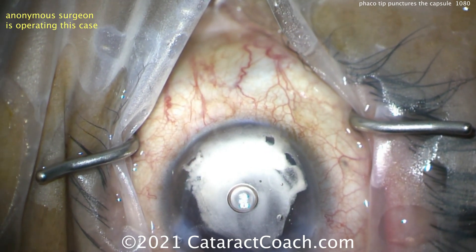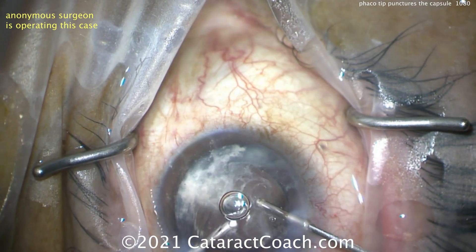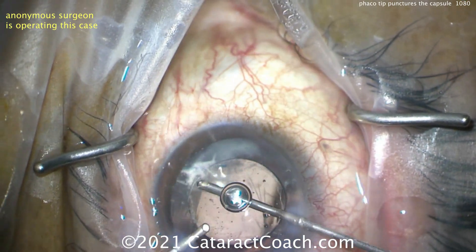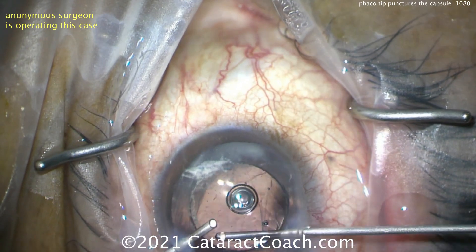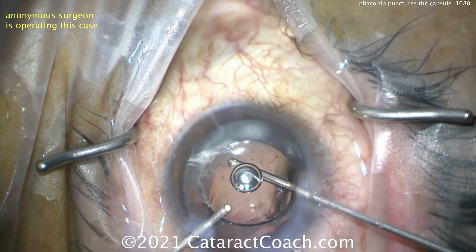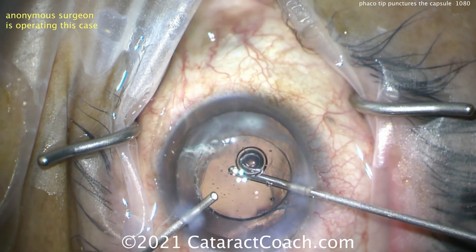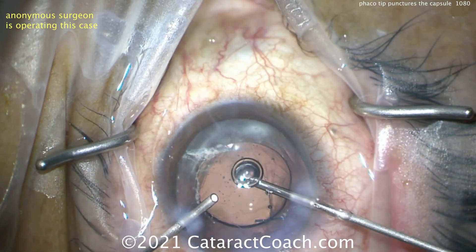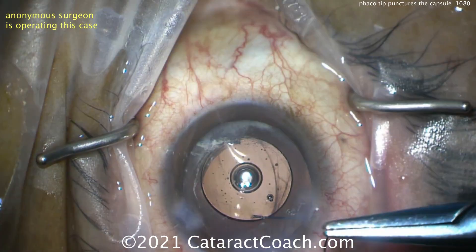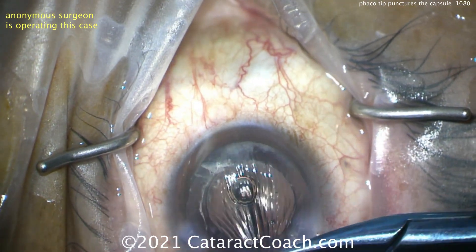That's a generous amount of triamcinolone. Now let's put in the bimanual instruments again — the anterior vitrector first. Put some BSS in there and swirl around. Look — there's extra vitreous right there, you can see it. You have to remove that. You can't leave that haptic entangled with vitreous. Remember, post-op this patient is at higher risk for retinal detachment due to vitreous traction, higher risk of cystoid macular edema, and higher risk of endophthalmitis.